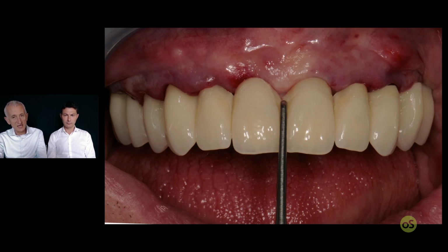you take the shell and you make the try. Okay, this is the first try that you do. You have not tried anything with the bar so far. So you put the bar, you put the shell. If the shell is touching, is hitting, if there is any obstacle to the fitting of the shell on the framework, you can cut some metal or remove some acrylic, whatever fits best to you. But at the end, the shell has to fit passively on the framework.